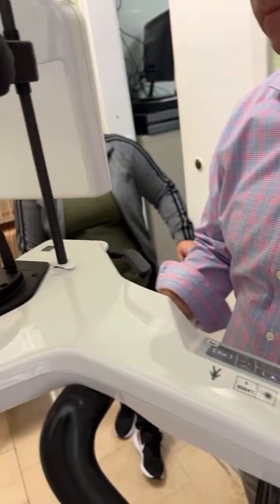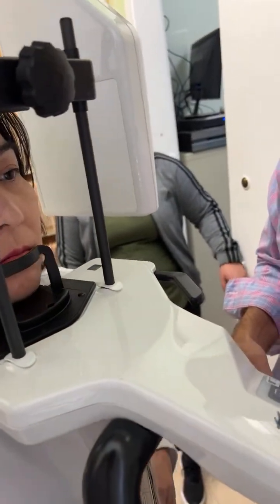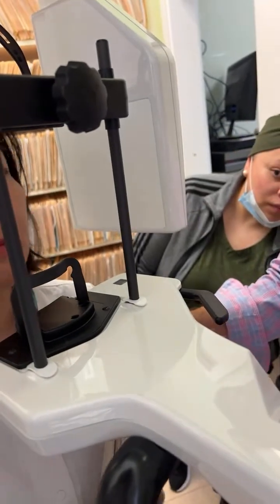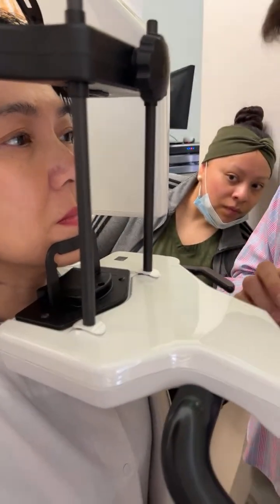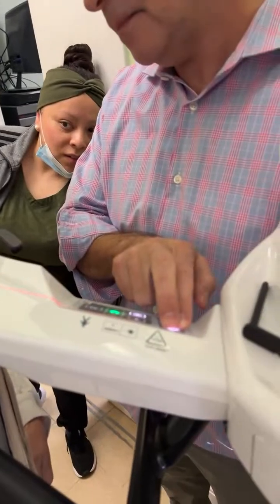I switched to 6 by 9, so that's 6. Stand up tall. See how tall she is? Look at all the space we still have. A lot of people will slouch. Oh yeah, now go up all the way here.